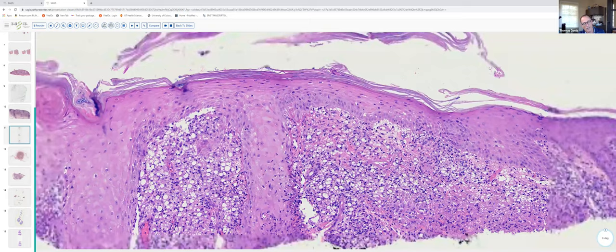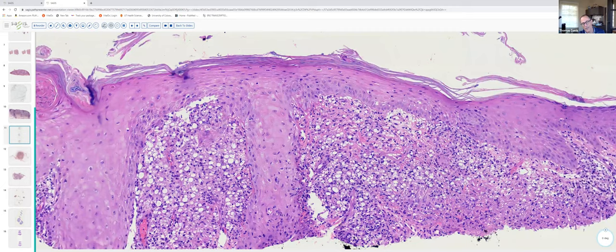There have been some studies in the recent literature looking at the utility of CD1a staining to identify the amastigotes in leishmaniasis. In my experience with new world leishmaniasis, CD1a staining will highlight these organisms as well.